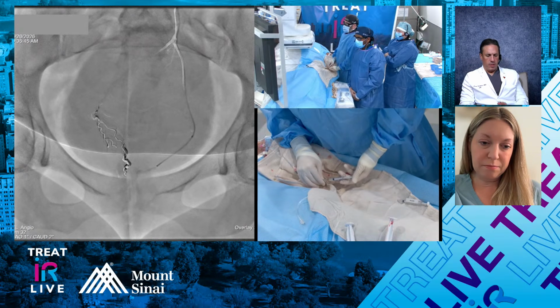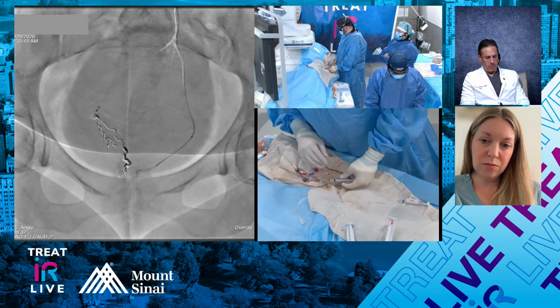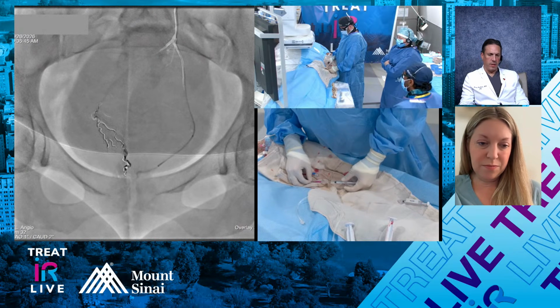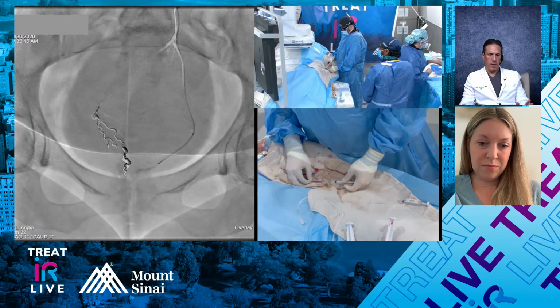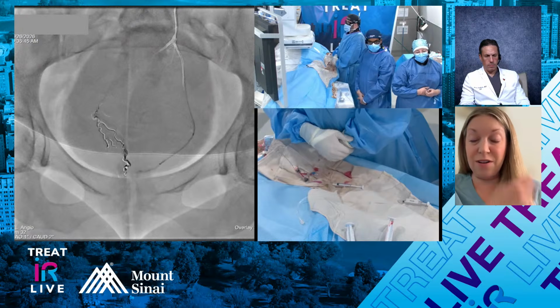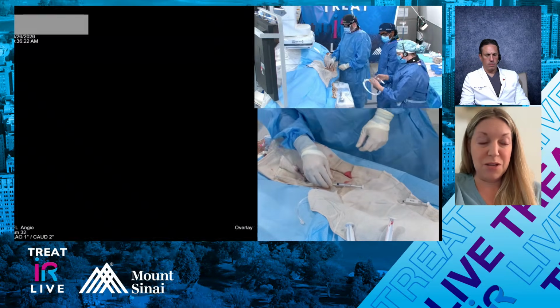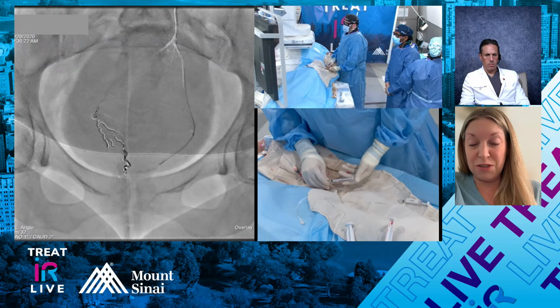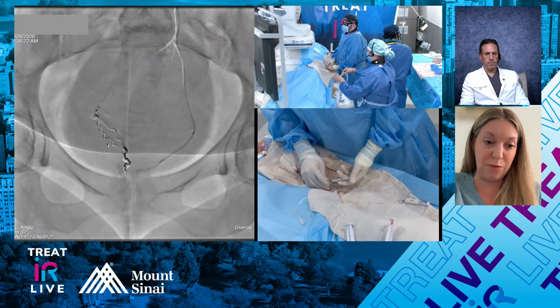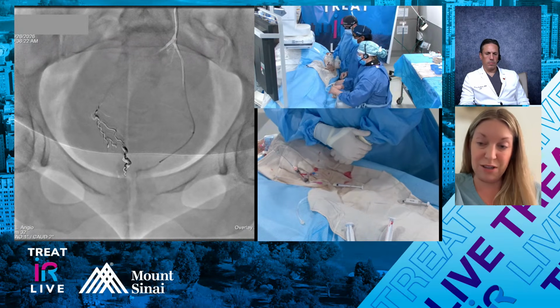Jesse, what do we tell patients about recurrence? So you have a great embolization result, 4 to 5 vessels are embolized. What do we tell patients about success rates, but also about recurrence rates at, let's say, a year, 2 years? We don't have good data out to several years, obviously, but I tell them that basically all treatments for hemorrhoids have a recurrence risk, even hemorrhoidectomy. They don't treat every single column, because then they're at risk for stenosis and things like that. So everything has a risk for recurrence.